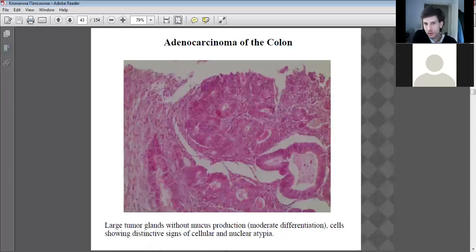Perhaps this, if the professor asks, is any normal? Perhaps this one is still a bit normal. The nuclei are still in their normal roundish pattern with a round or elongated lumen. But most of the areas here are abnormal. Some fibrous tissue infiltrating to try and localize the carcinoma. Okay.